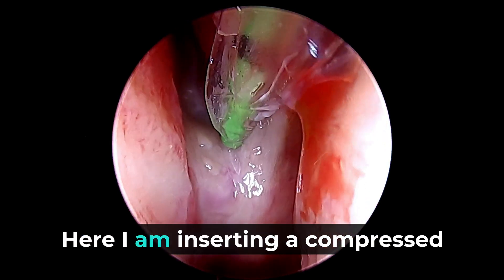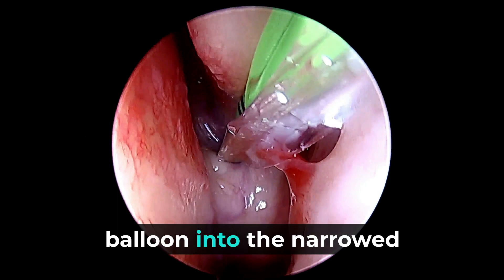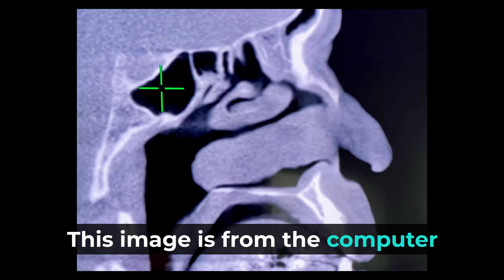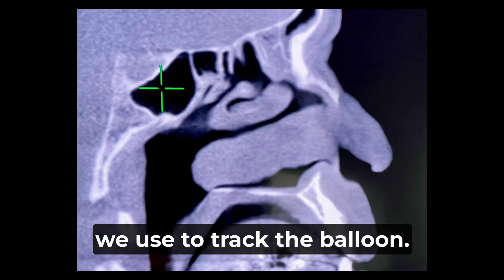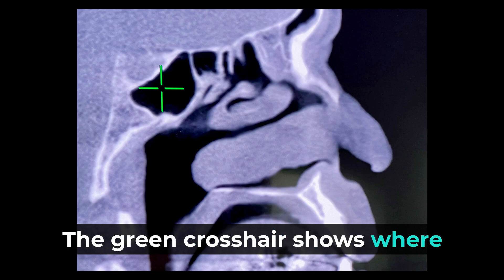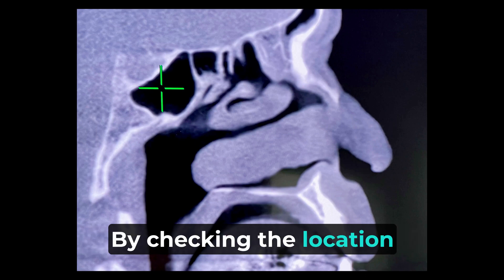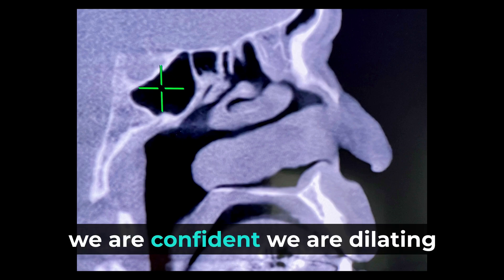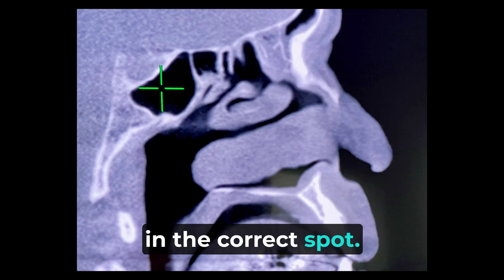Here, I am inserting a compressed balloon into the narrowed opening. This image is from the computer we use to track the balloon. The green crosshair shows where the tip of the balloon is. By checking the location of the balloon tip, we are confident we are dilating in the correct spot.